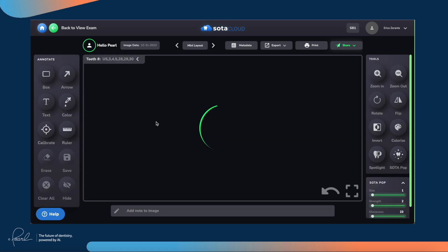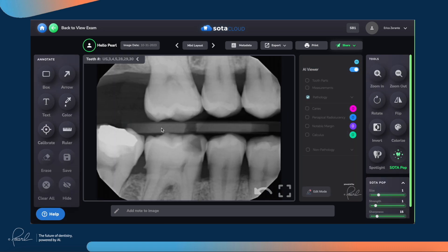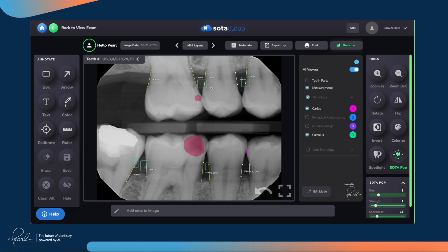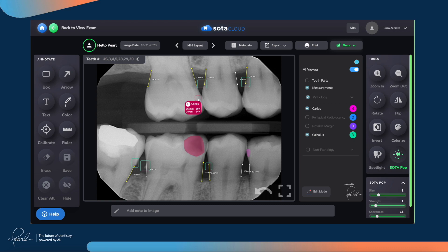When you select the image that you want to view, Pearl will automatically highlight all of the different areas of interest that the AI has detected. You have bone level measurements with different colors indicating different bone heights, green is calculus, pink and red are caries, and depending on the depth of the lesion, when you hover over a caries, you will see how far into the tooth the decay has encroached.